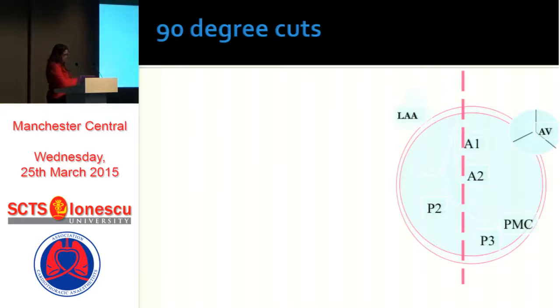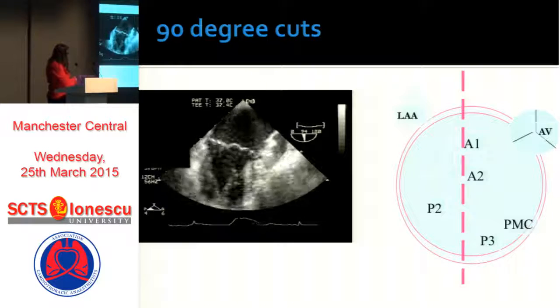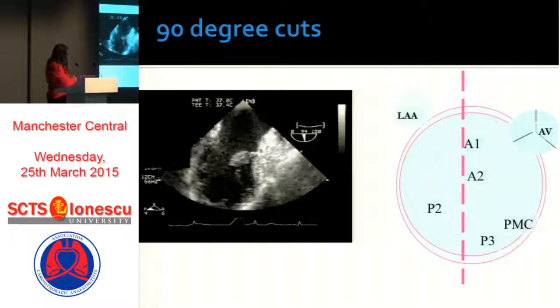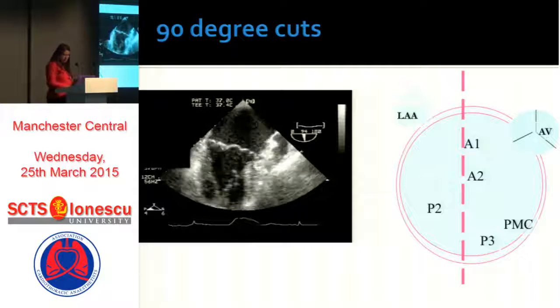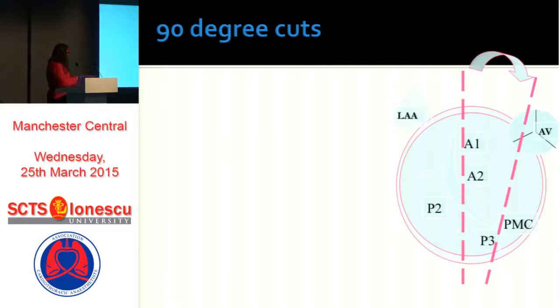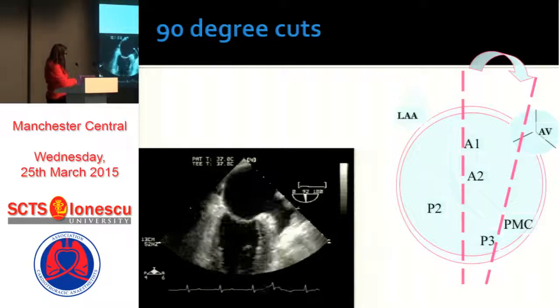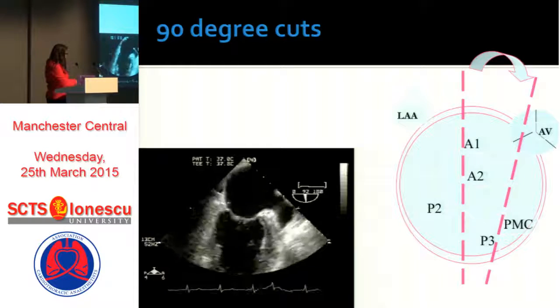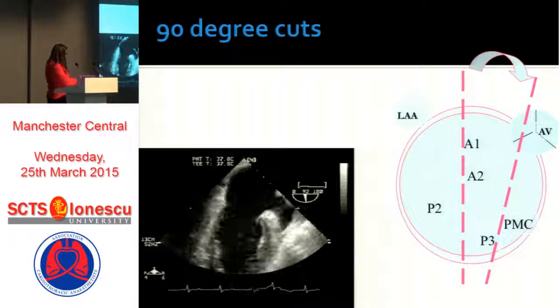At 90 degrees, orthogonal to the zero-degree view, you should cut through A1 and A2 then P3 at the end. On the TOE picture you see a long anterior leaflet and a smaller posterior leaflet — the base of the anterior leaflet is A1, the coaptation point is A2, and on the other side is P3. If you rotate to bring the aortic valve into the cut plane, you can then cut through the posteromedial commissure — that is a true commissural view.